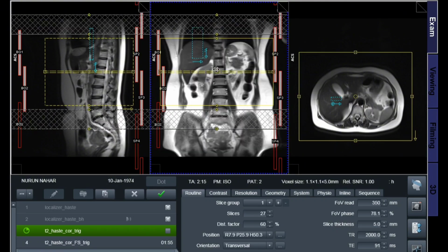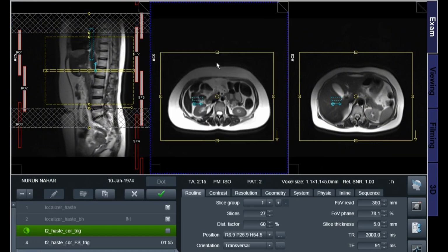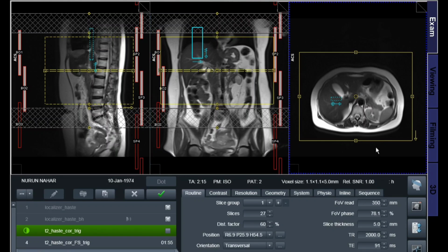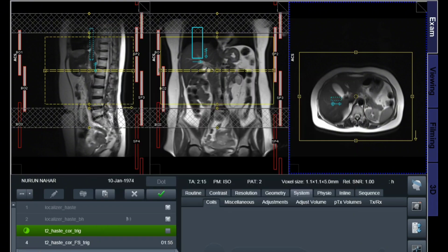Hepatobiliary System anatomy. The hepatobiliary system includes liver, gallbladder, intrahepatic bile ducts, extrahepatic bile ducts, common bile duct, CBD, pancreas, partially evaluated. The liver produces bile, which is stored in the gallbladder and transported through the bile ducts into the duodenum.